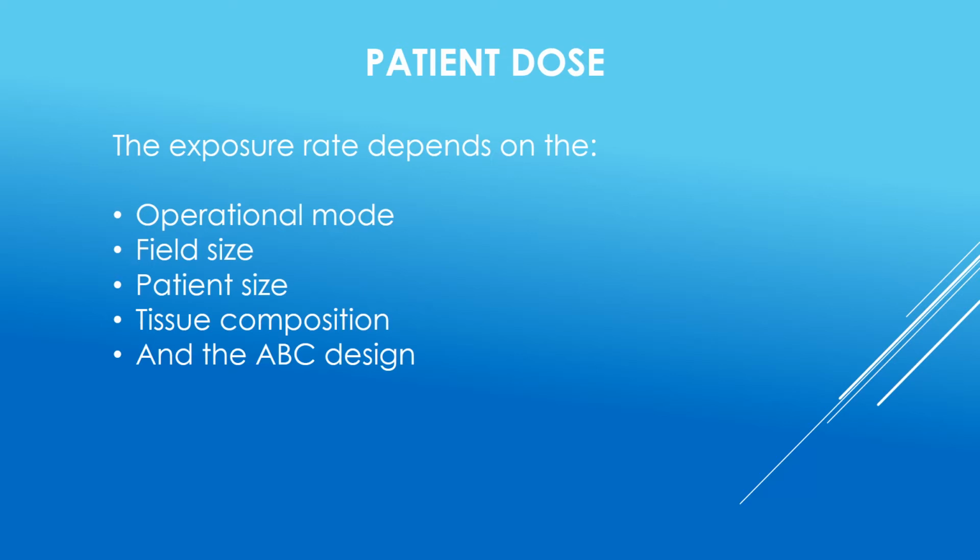Patient dose. The exposure rate depends on the operational mode, the field size, the patient size, the tissue composition, and the ABC design. ABC stands for Automatic Brightness Control.